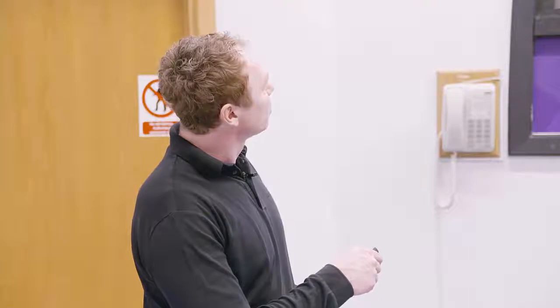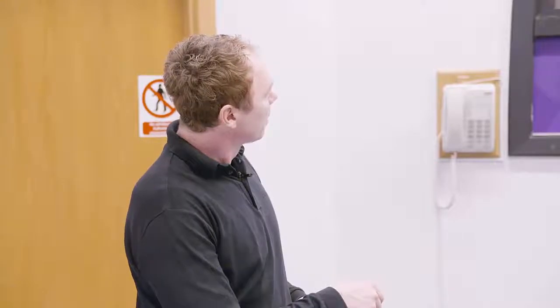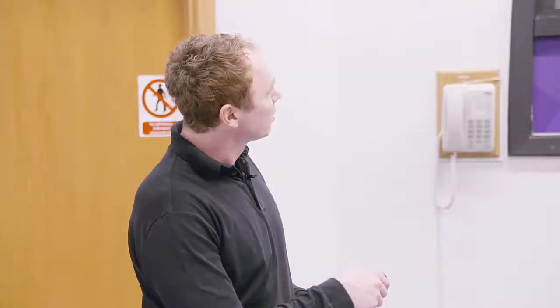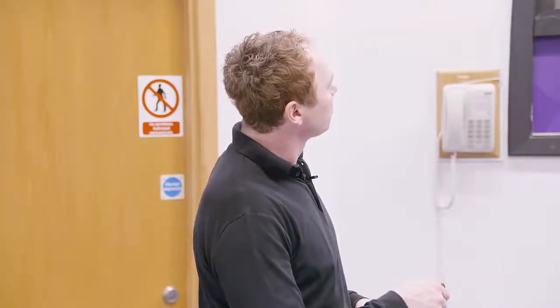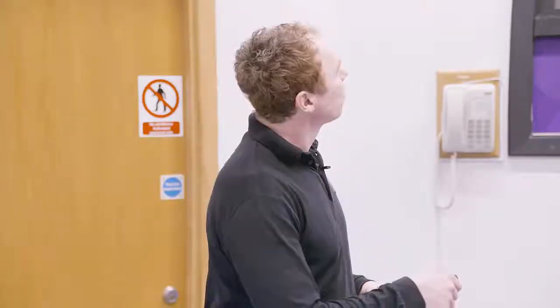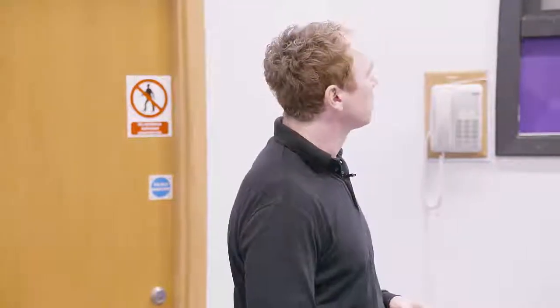Then what you get is a comparison to the reference values. First you compare the contraction time. So you have all the muscles again here, left and right side. Again, what you would like to see is everything in green. If you have everything in green, that means all of your muscles are faster than the reference values. If you are just a bit outside, up to 20% slower than the average, you're in the adequate area. That means you're not fast, but good enough. If you are outside that area, the muscle would be too slow, and again a warning and recommendation would be given.